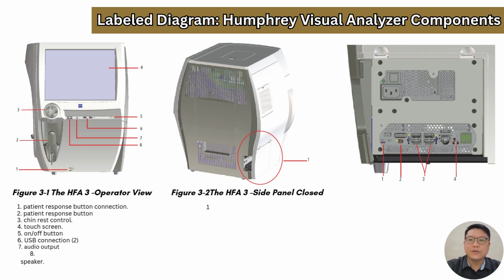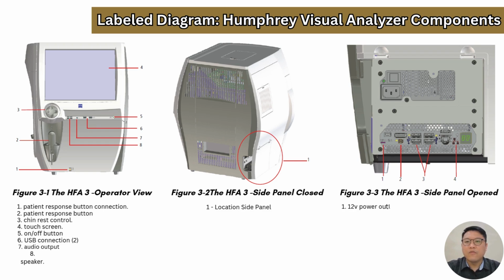In the second picture, we see the left side panel, which houses various ports and connection points for the device's function. In the third picture, the ports are shown in detail. The 12-volt power outlet connects the device to its power source. The display port can connect to an external monitor.